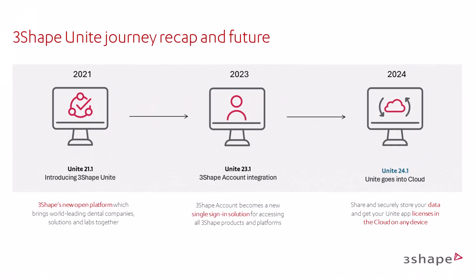Our story with Unite platform began with Unite 21.1 in 2021. The new open platform brought together world-leading dental company solutions and labs. Then, in 2023, as part of Unite 23.1, the second generation of 3Shape Unite was introduced, featuring the concept of 3Shape Account. In that version, 3Shape Account became a new single solution for accessing all 3Shape products and platforms.